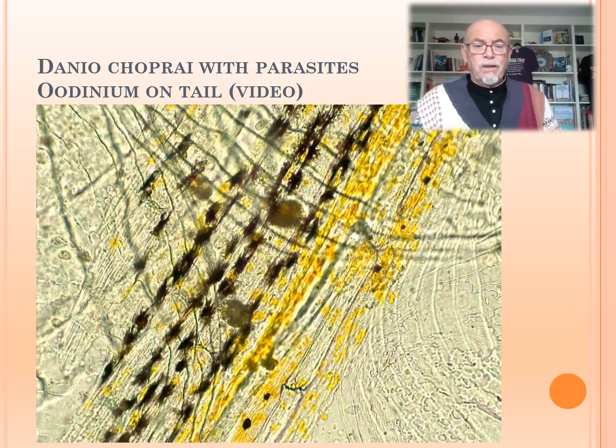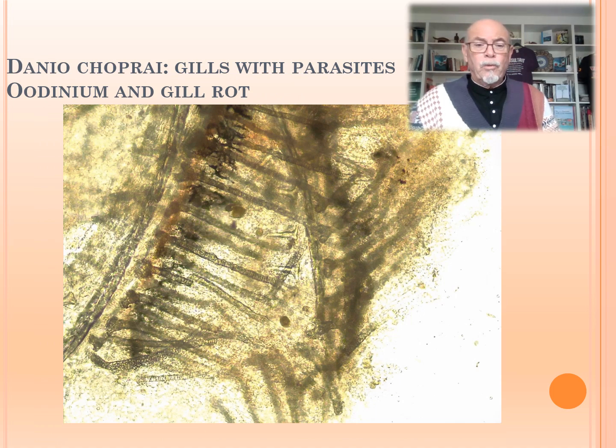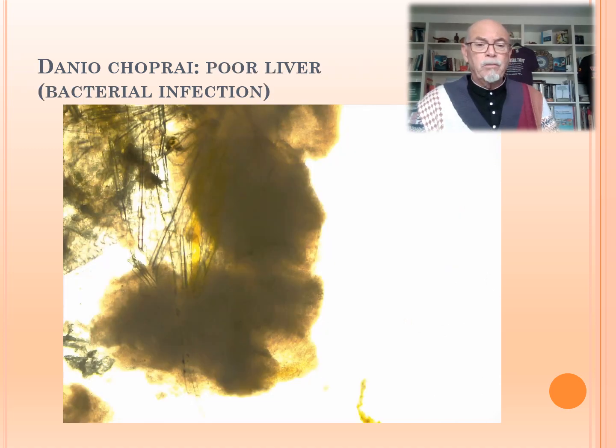And that's why the fish shows the behavior. And the problem is then, particularly in the gills, that you also have parasites there. Here you see a couple of them. And you also have here the bacterial infection. And the bacterial infection is causing, well, the fish to die eventually, waste away and die. That's the problem when parasites come in, that parasites cause damage and the bacteria can come.